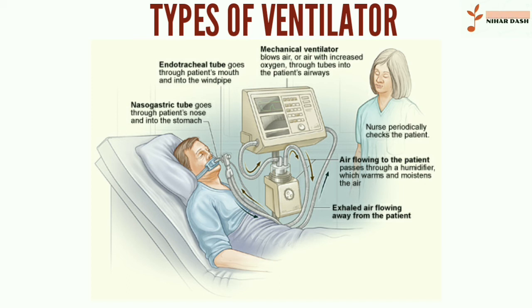Non-invasive: the patient wears a mask that fits over the nose and mouth, and the air blows into their lungs. Depending on the condition of the patient, a respiratory therapist will determine what type of ventilator will be used for them.